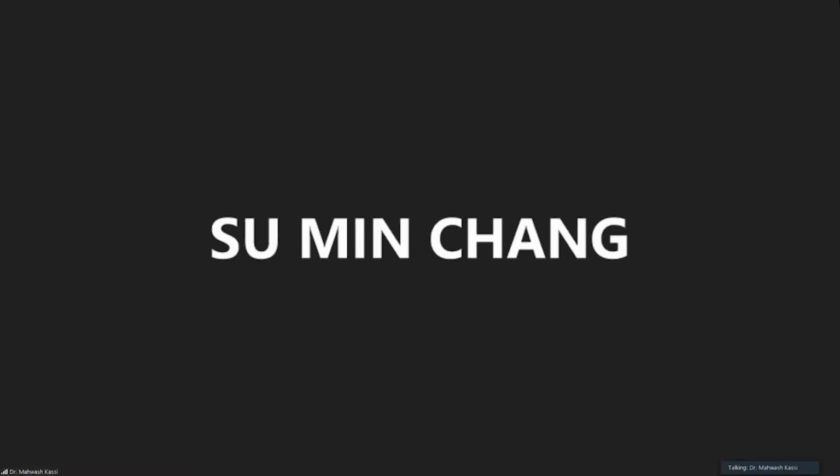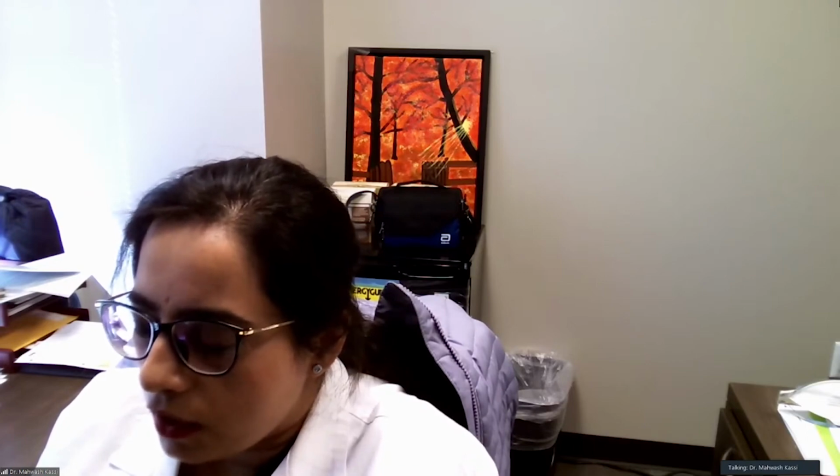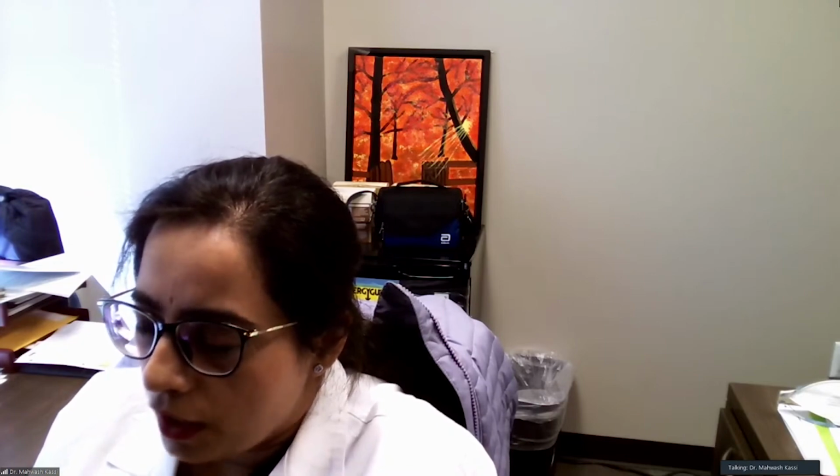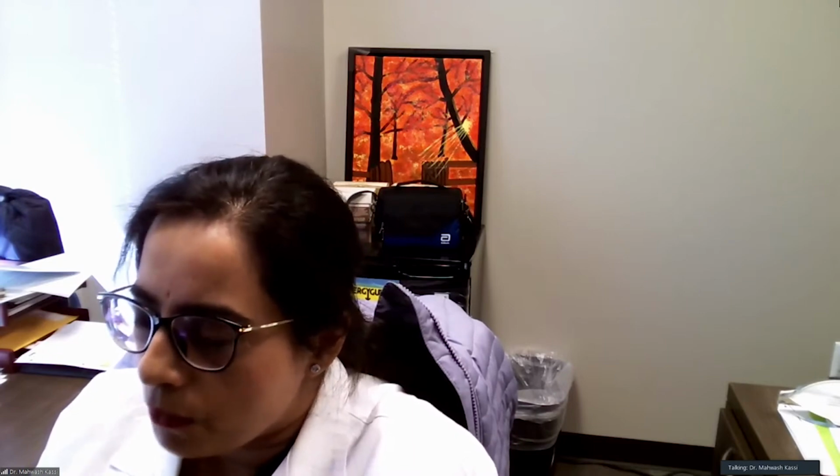So we looked at all the scans for a few years, and we saw that there is root thrombosis, and whenever it happens, it can cause devastating complications. What we've done, being extra cautious with our patients, to make sure that when we're doing any kind of speed changes they don't have aortic root thrombus, is that we have this surveillance CT scan. We try to time their CT scan ahead of the actual RAMP study. And in those patients who have abnormal kidney function, we cannot do the CT scan, so we do an echo with contrast to make sure that they don't have a root thrombus. So that's in our protocol.